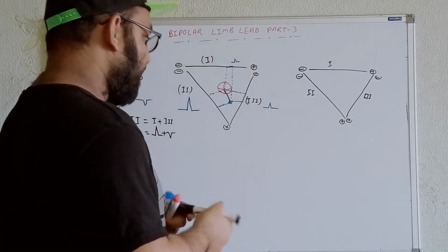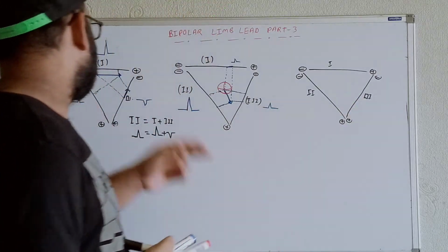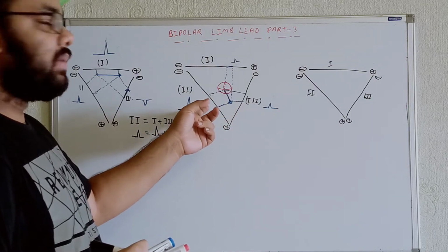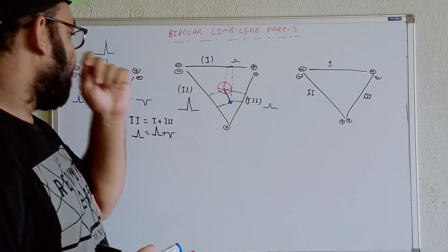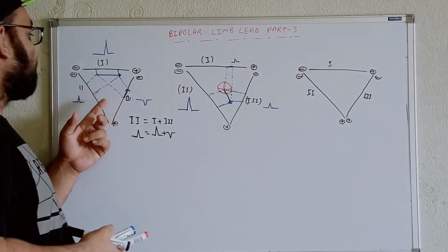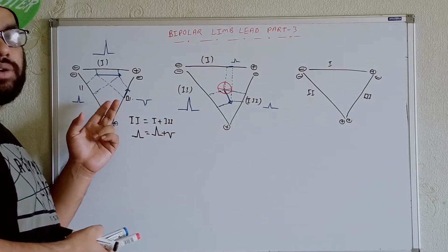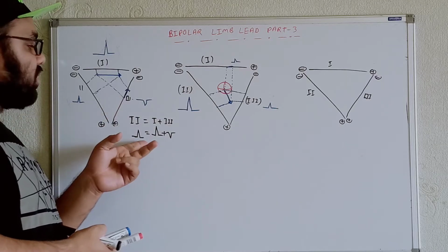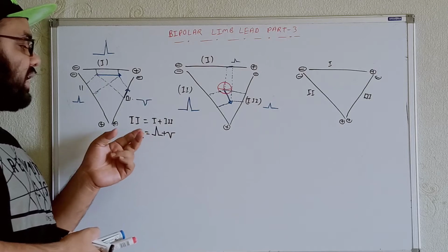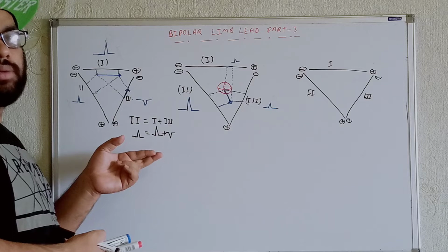Now for example, we are getting the major ventricular depolarization that is parallel to lead number 3. And the first thing we got, normally what we get in these cases, leftward and downward, that will be parallel to lead number 2. For it, what we got was the normal equation from Einthoven's triangle. In the second case, I did talk about, for example, the major ventricular depolarization whose axis, the axis of this vector, is parallel to lead number 1. Here we also got the same equation. It will still be fixed. That means ultimately the addition of leads 1 and 3, the potential difference, will be equal to the potential difference for lead number 2.